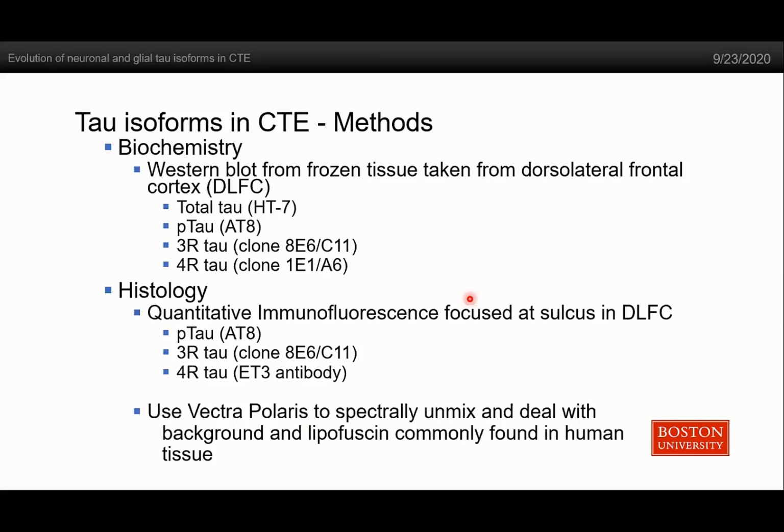So they generally have a lot of issues with background and non-pathologic protein aggregates that are quite fluorescent, which really hamper a lot of human neuropathology analysis with immunofluorescence. So part of the goal of this project was to develop techniques where we could better look at human neuropathology in these heavily fixed, old-age samples, to find markers that let us do these multiplex stains.